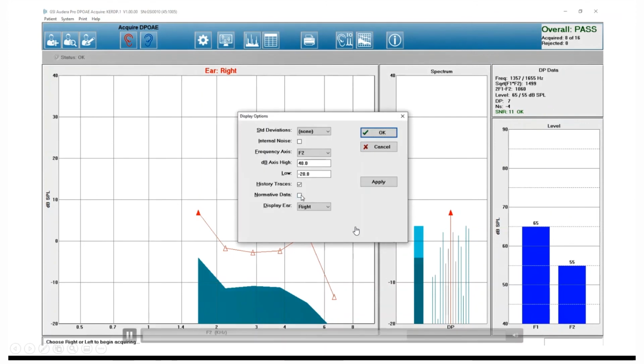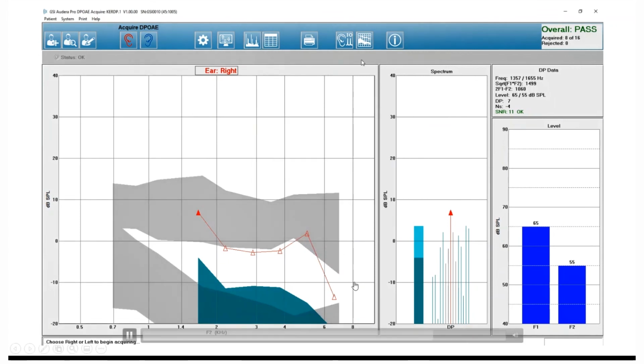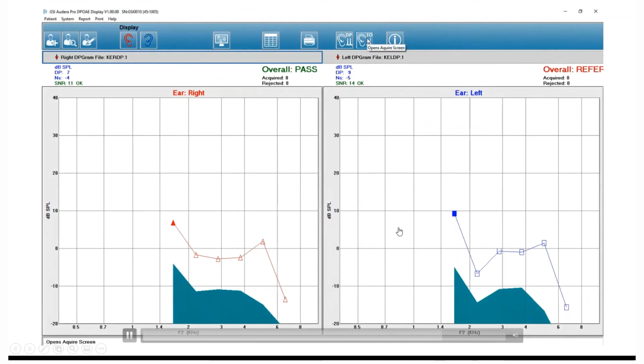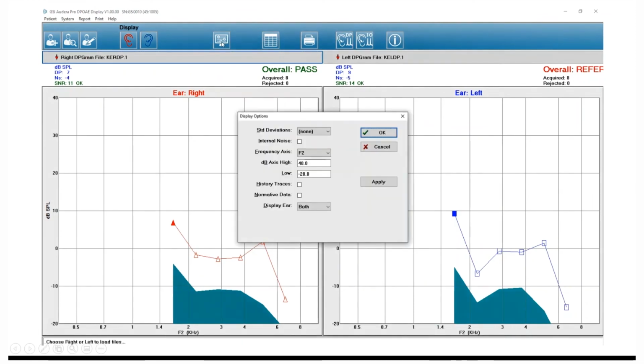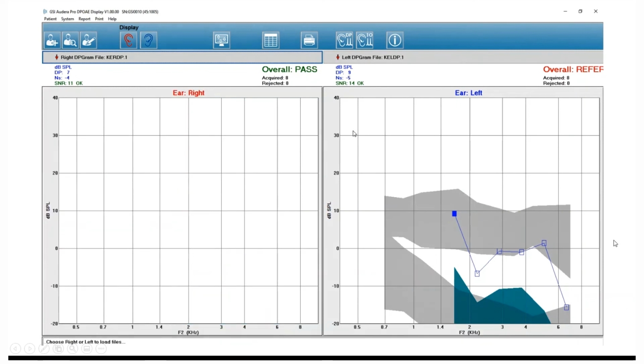If I want, I can add normative data to the screen. I can select norms and apply. These are young normal hearing. And now I'm going to navigate over to the display screen. I want to put some norms on my display screen so you can see what it looks like. I passed in my right ear, referred in my left ear. So you can see both ears displayed side by side.